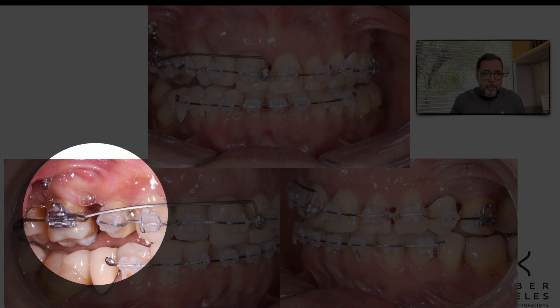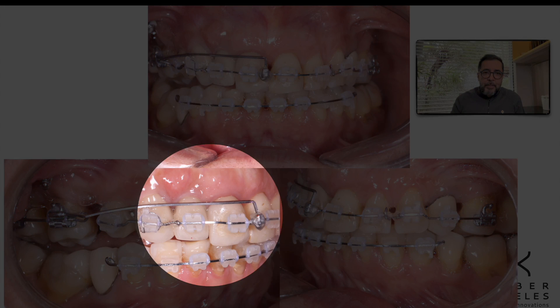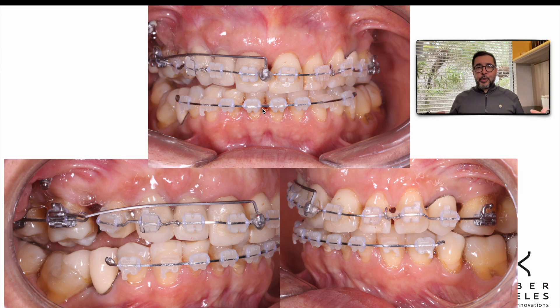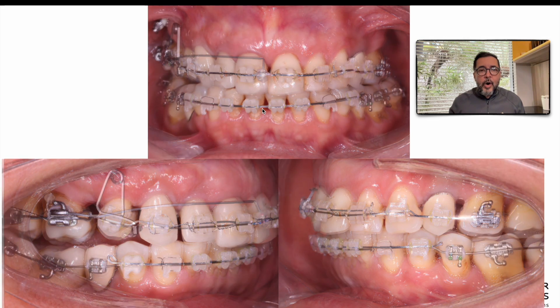This is the day that I applied the two-couple system. We did a video with the patient that very day — she was very happy because she was seeing the case going fast. The correction of the midline, which was her chief complaint, was going fast. One month later, I had this: keeping the molar with the same space because the TMA strip was cinched back. Now we have an overjet in the anterior segment, allowing me to go further with the retraction. So I stopped this mechanics and went on with the retraction using the same strategy again, closing the space and retracting.